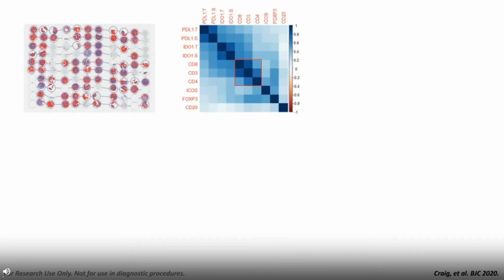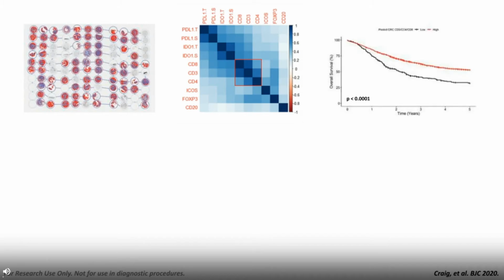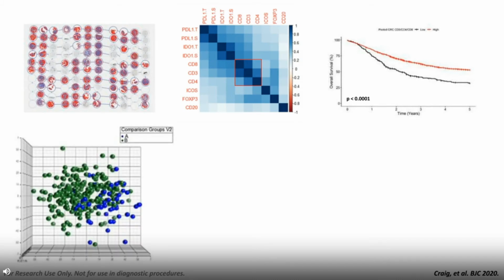And this digitization of the data meant then we could use sophisticated statistical techniques to look at subgroupings present in the cohorts and how these potentially could affect survival. And once we identify a good survival stratifier, because this data is now digital, we can integrate it with other data sets, such as multi-omic data sets. So we then combine this data with RNA microarrays to see, well, is there a transcriptional subtype with this phenotype we've identified through tissue-based analysis? And it appeared that there was.